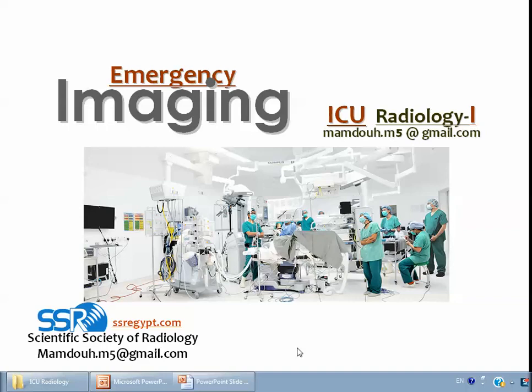Dear colleagues, this lecture is about the intensive care radiology with particular emphasis on the role of examination of the chest by different modalities in the ICU patients. The topic will be handled in two parts.